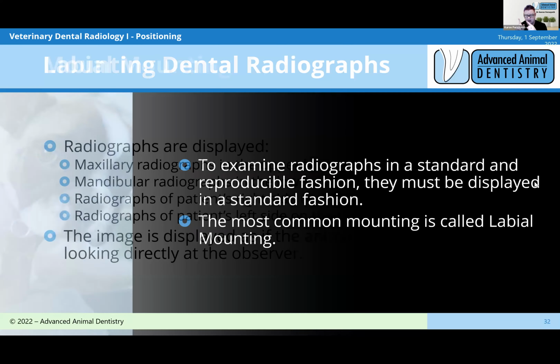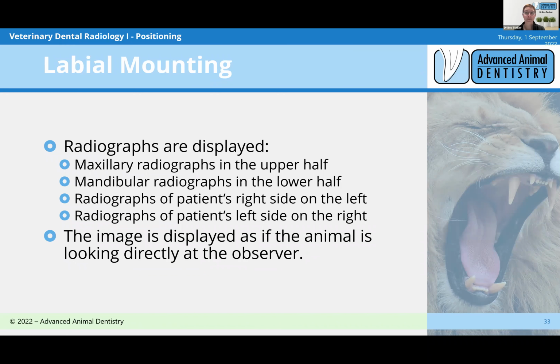Unless, and I've never done it, you've taken the image with the plate around the wrong way. Or you do an extra oral, but you just need to mark that it's extra oral.